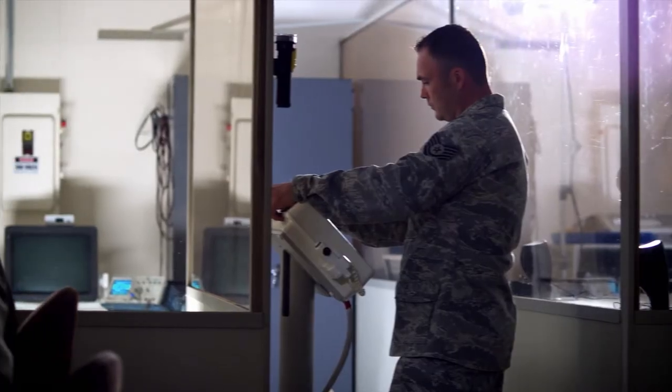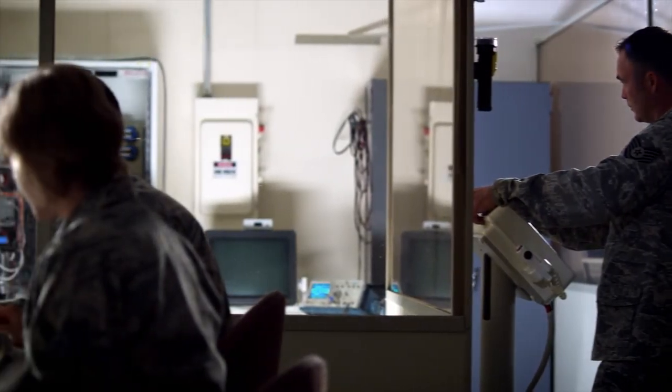In the past if something was wrong with medical equipment you'd normally have to replace an entire board, but we're trained here to troubleshoot to find out if it's an actual component.